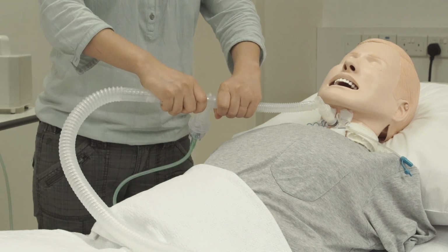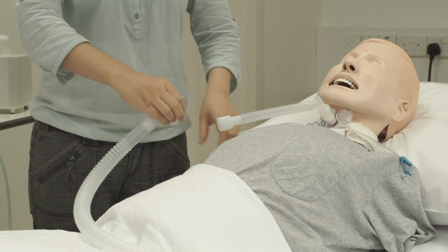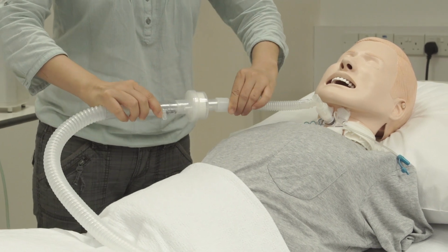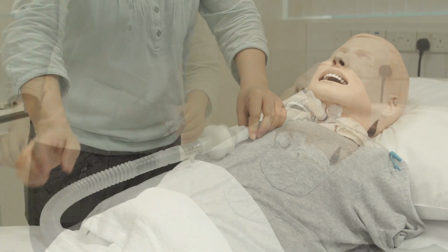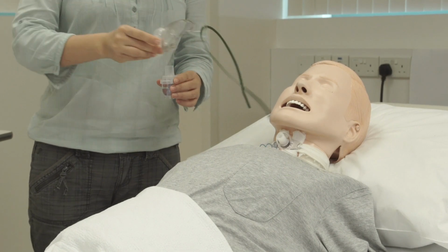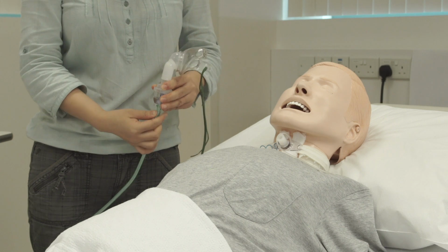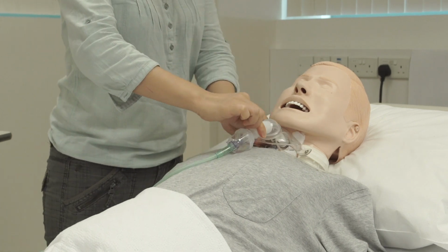When medication is completed, remove the chamber and put the HME back. Ventilate as usual. When the patient is not using the ventilator, connect the chamber to the trach mask and strap it around the patient's neck.